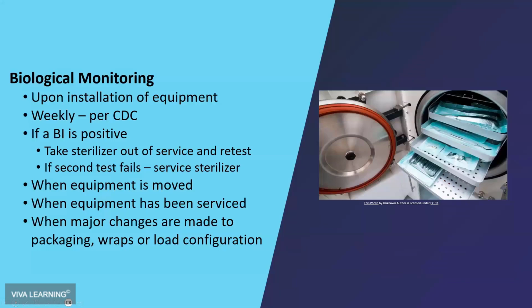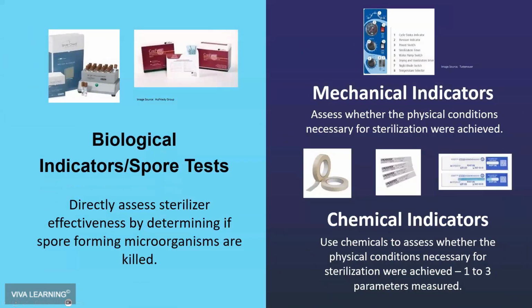And if you're not sure how to do it, then contact that sterilizer manufacturer and find out what they recommend. There are load maximums, in other words, how many cassettes or how many instrument packages you can put in a particular load, and so forth. So always follow the manufacturer's instructions for use. The important thing is that you have to allow for the circulation of steam in that autoclave, because remember, it has to penetrate into the packages.